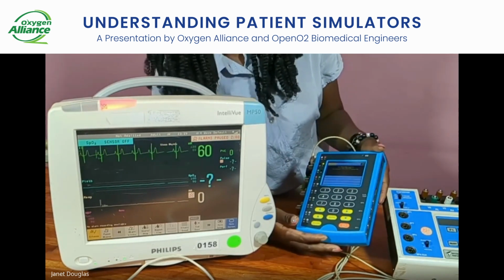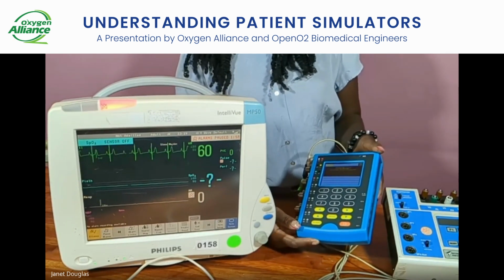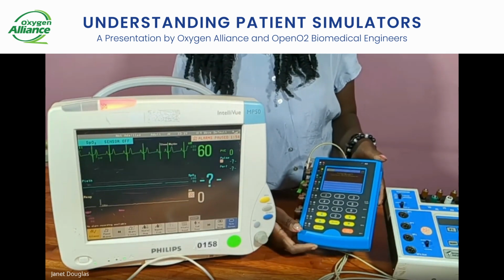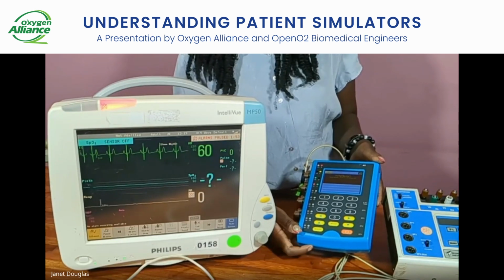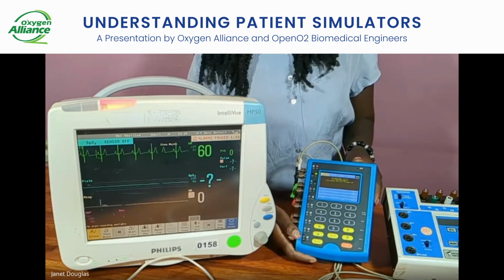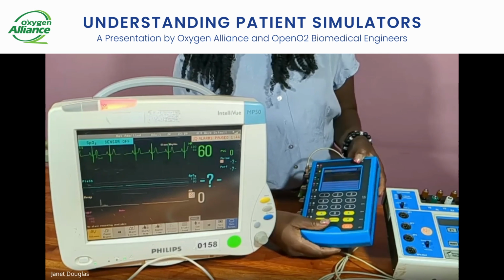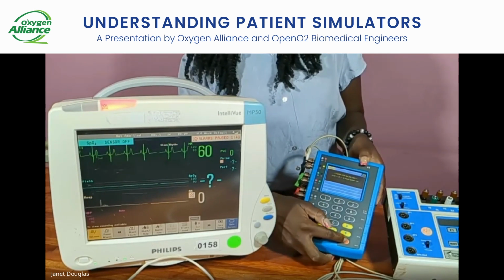So these are the things that you're supposed to check, and you also have to navigate through. Like I said earlier, it doesn't matter the amplitude, it doesn't matter the things that you are trying to check or navigate through. If your device is working properly, it's still supposed to give you the results. And if you are done, you can clear and you can switch it off.